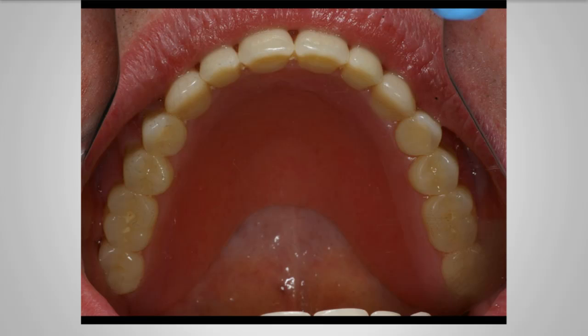What I found is if you make vents, many times not only does it extrude out of the vents, but one cannot get the polish on that internal aspect like a laboratory can, and so then the patient's tongue starts playing with the lingual aspect of those vents. So I will purposely not place vents myself.